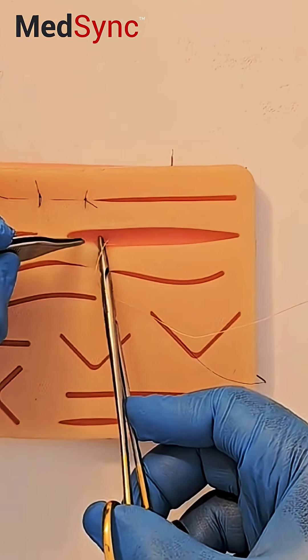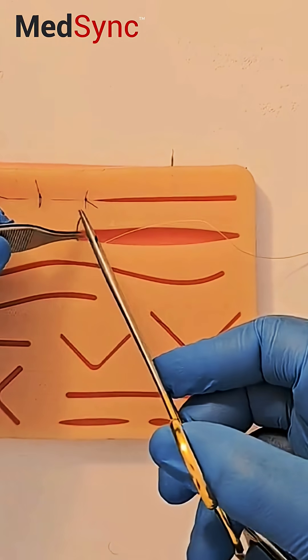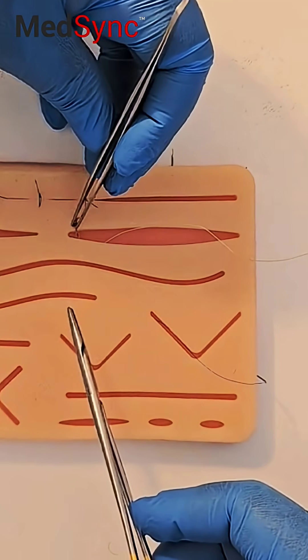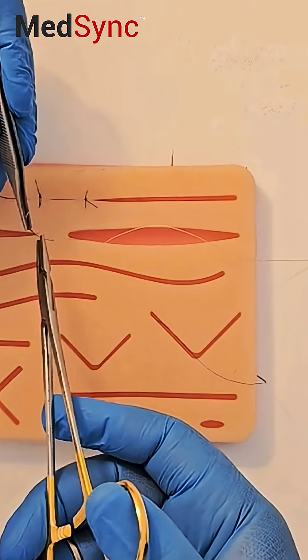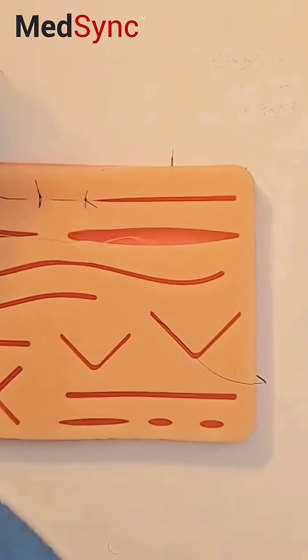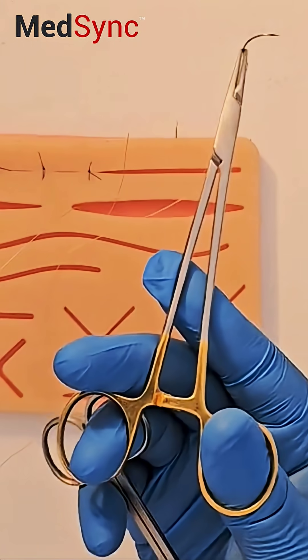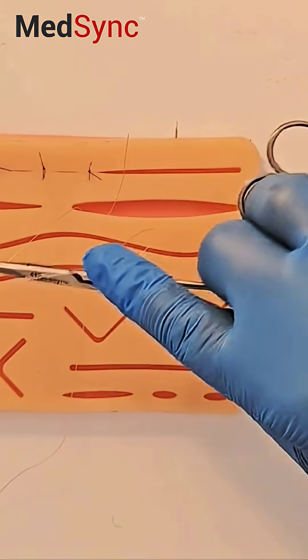So for the deep dermal, you go from deep to superficial. I need to continue suturing, so grab it with the forcep, like so, mount it straight away so I don't waste time.